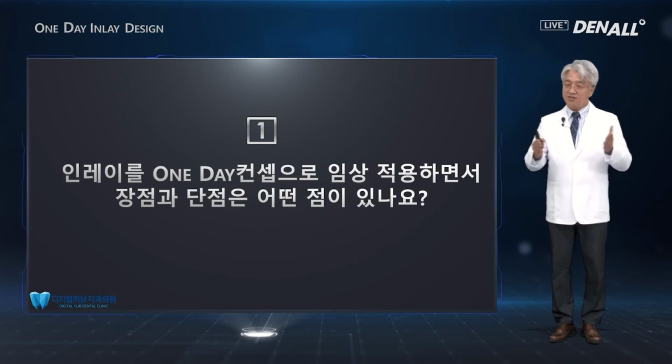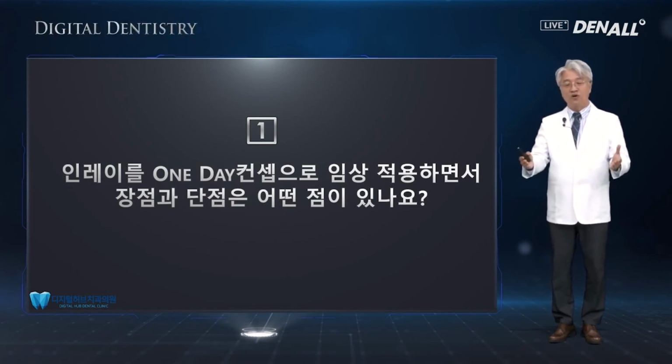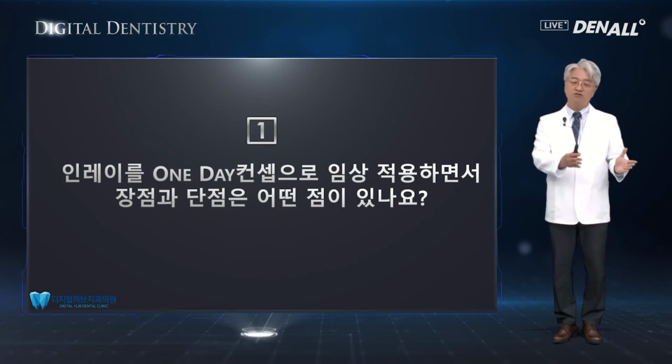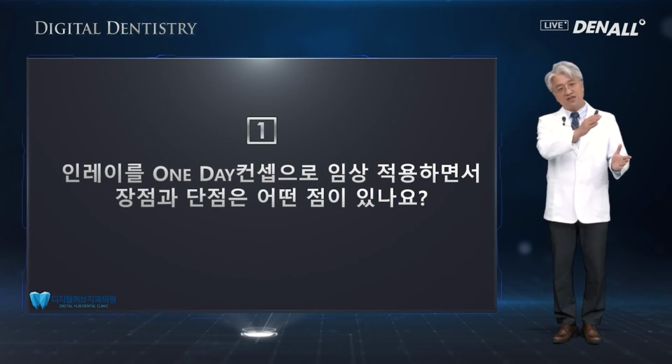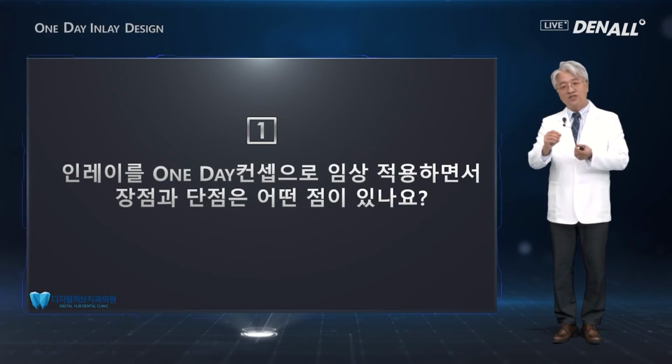All the more with the adoption of CAD/CAM systems, with the CAD/CAM software, 3D printers, and oral scanner advancements, compared to when you had to work analogly. You had to do a rubber impression, you had to do stone work, and in CAD you do design, but in actual inlay, you have to make the inlay manually, which takes a lot of time and effort.